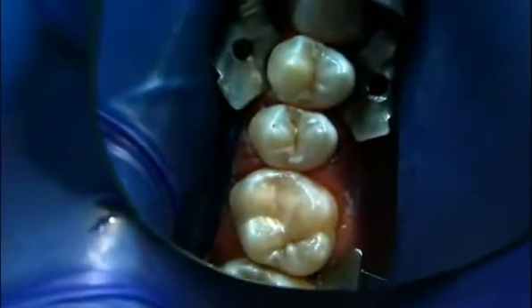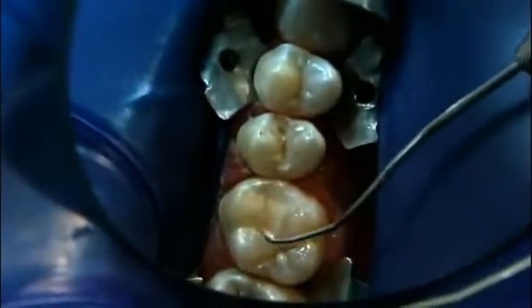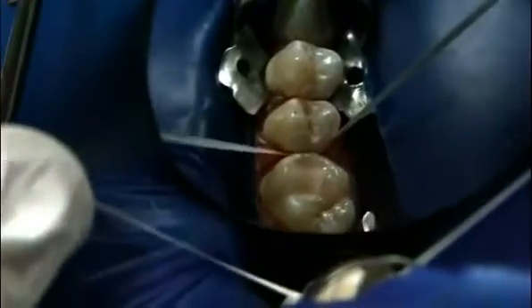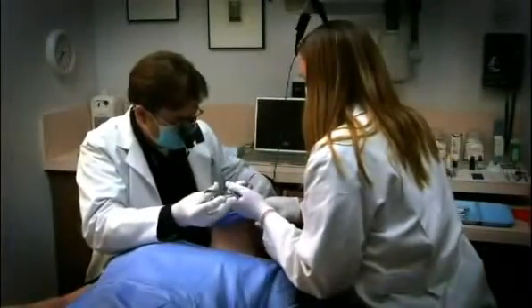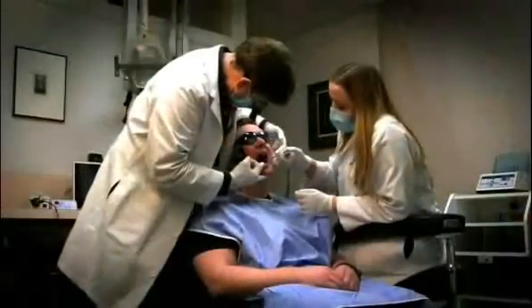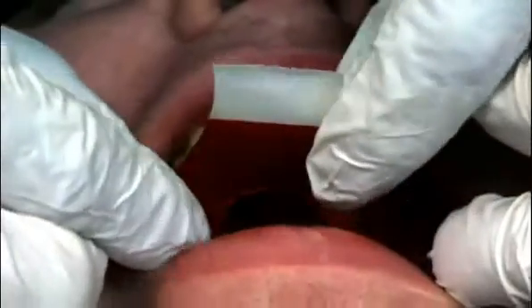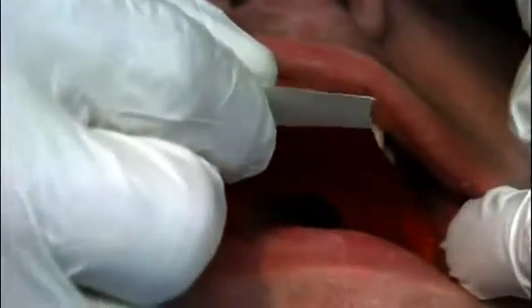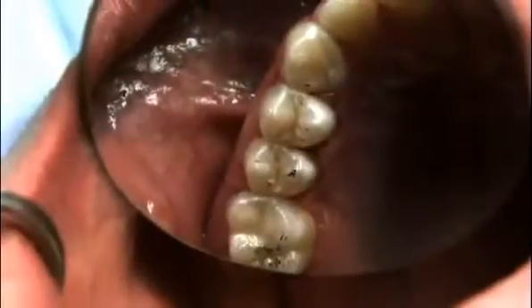The completed restoration shows harmonious integration of this improved glass ionomer system with tooth structure. The proximal contacts are inspected for any residual resin coating using unwaxed floss. The dental dam is removed, the patient is placed in an upright position, and the teeth are air dried. The patient is asked to perform closure without force, then centric occlusion is performed and inspected for any prematurities.